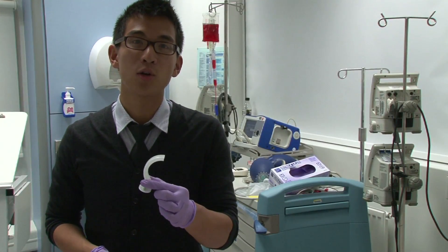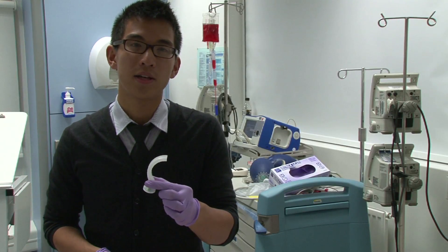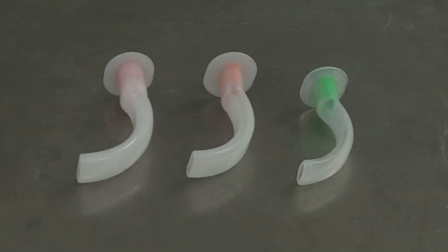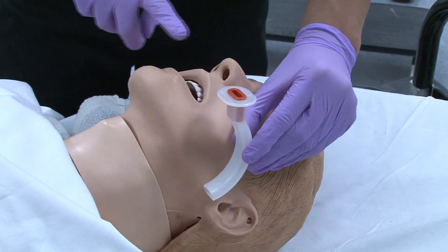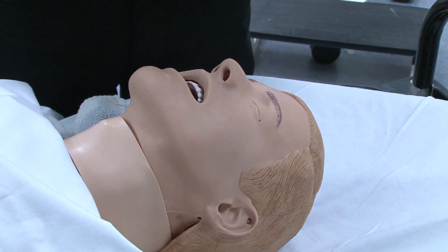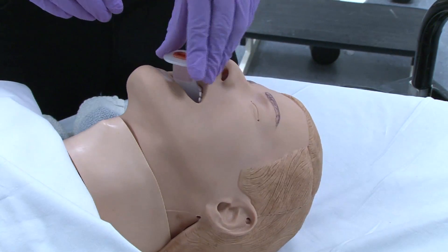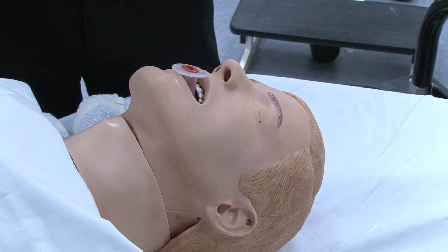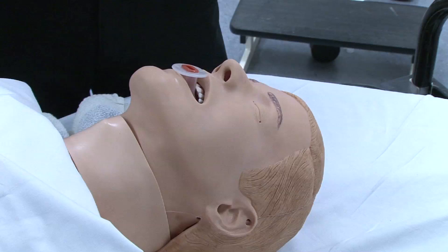This is an oropharyngeal airway, also known as a Guedel airway. It fits between the tongue and the hard palate. It should only be used in unconscious patients, otherwise it will stimulate a gag reflex. Oropharyngeal airways are available in various sizes. The correct size is determined by measuring the distance from the incisors to the angle of the mandible. To insert, introduce the airway in the upside-down position and rotate 180 degrees as it passes the hard palate. This minimises the risk of further obstructing the airway with the tongue. Correct placement will be demonstrated by the flattened section sitting between the patient's teeth.